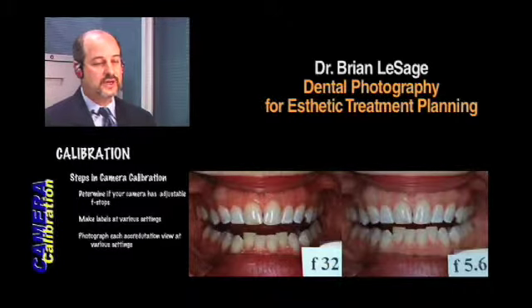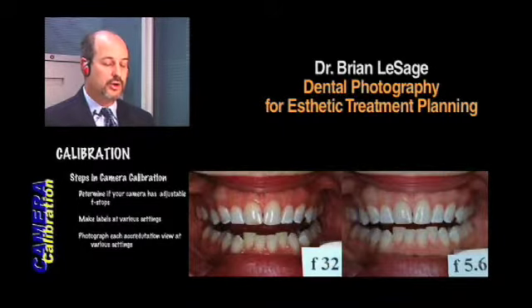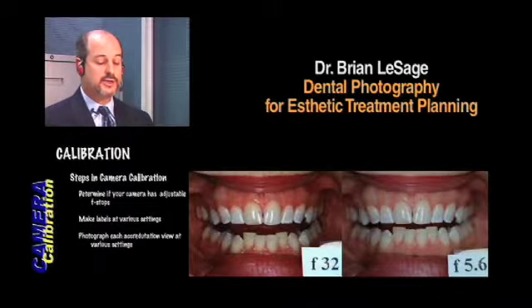So you can always tell, and that's what I do every time I take a picture on a new patient, new room, new day, whatever it may be. I look at the histogram quickly. It's usually right, but usually it's not good enough. So maybe it's correct 80% of the time. 20% of the time I have to go in and modify it to get the proper exposure. Calibrating will get you closer, probably 90+% of the time you'll get it correct. So what are you doing?